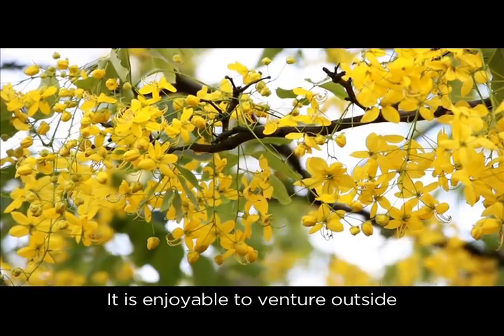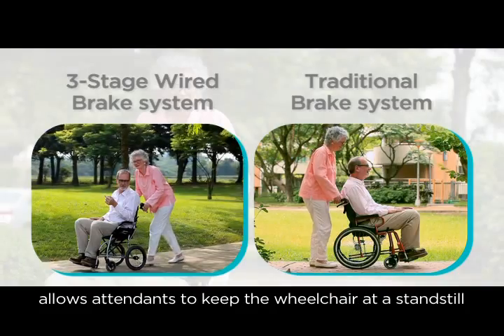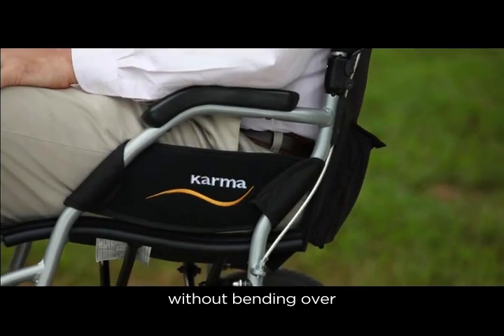It is enjoyable to venture outside. The three-stage brake system allows attendants to keep the wheelchair at a standstill without bending over.